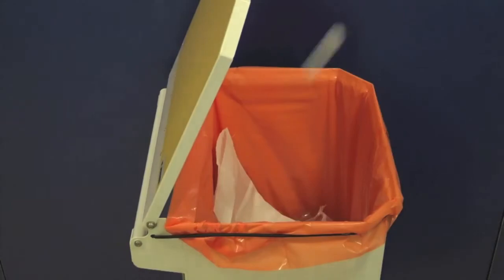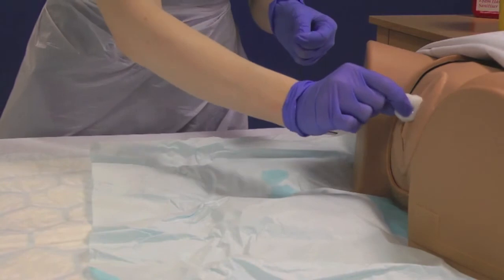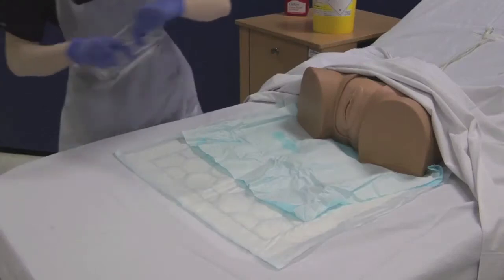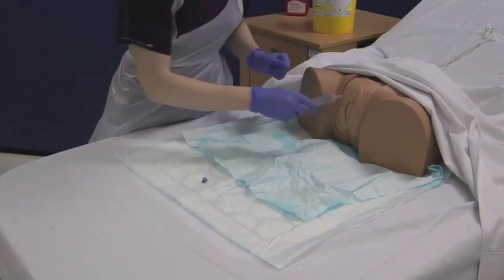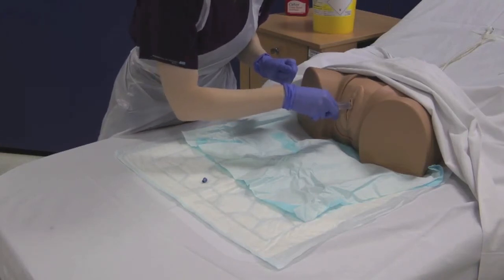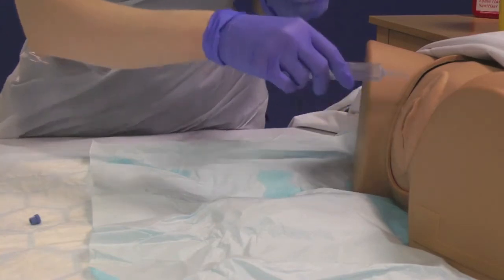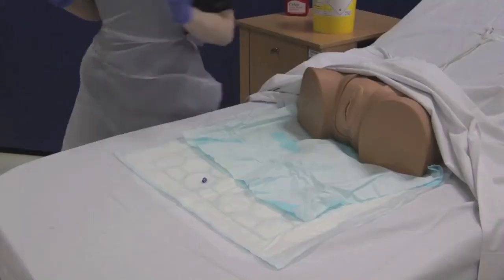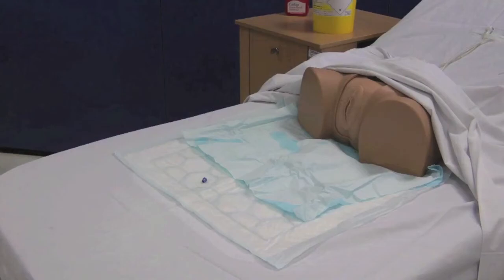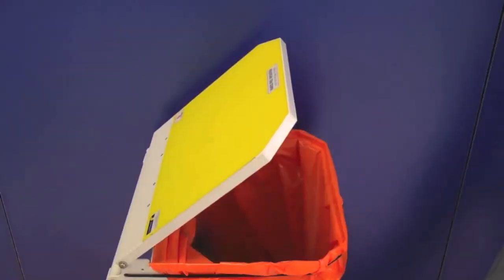Use a minimum of 5 cotton wool balls, cleaning from front to back, symmetrically from outside to in. Once you have finished cleaning the genitalia, take your instiller gel and insert only 6 milliliters into the urethra. Dispose of the syringe into the sharps bin. Allow 5 minutes for the gel to take effect. Remove your gloves and decontaminate your hands.